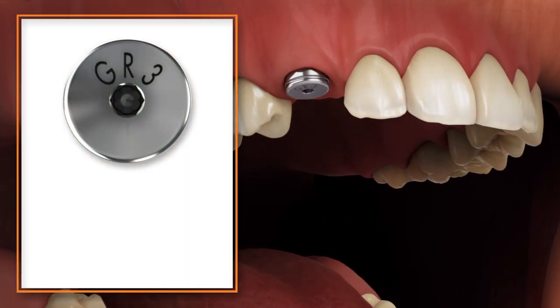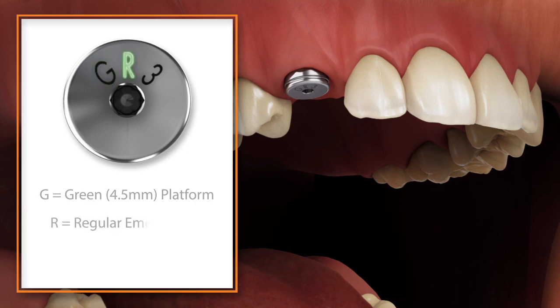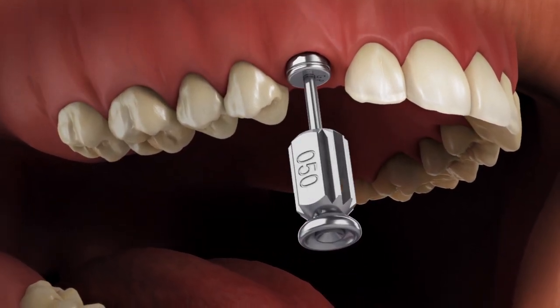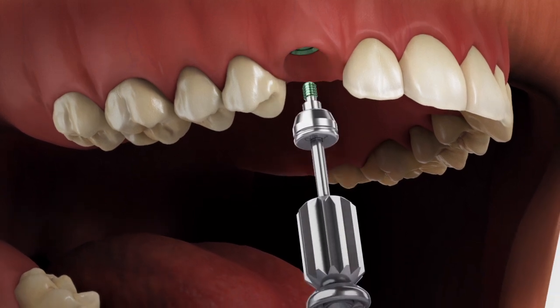Read the laser marking on the top of the healing abutment to verify the platform size, emergence, and collar height of the abutment. Remove the healing abutment and confirm that the prosthetic platform is free of any bone or soft tissue debris.